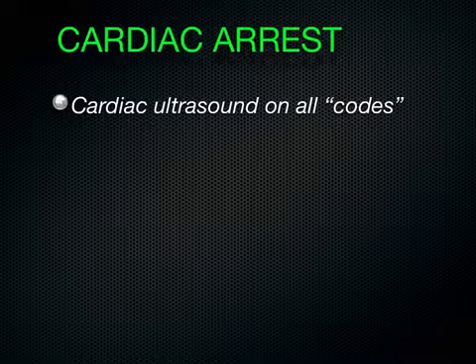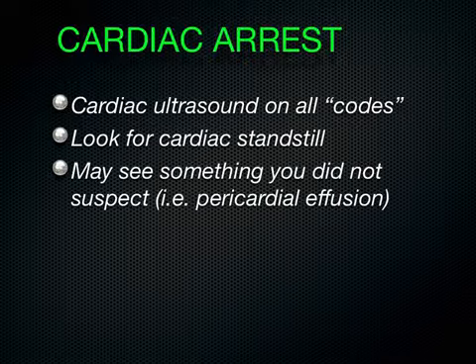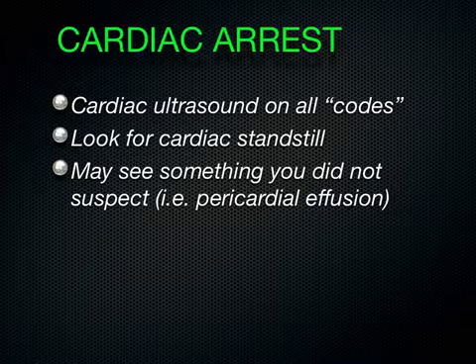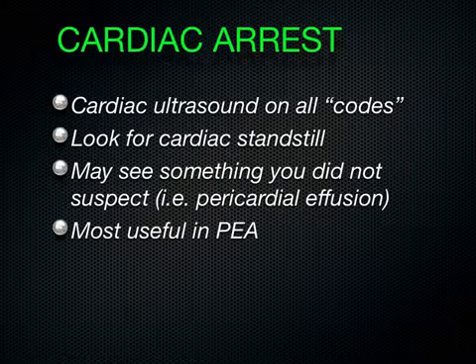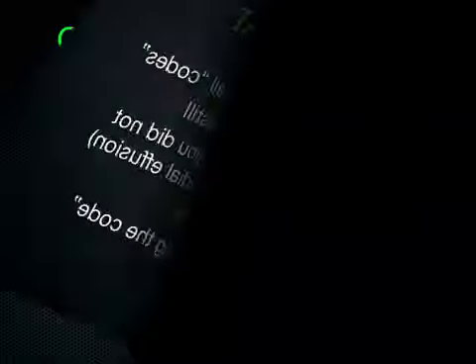Well, what about cardiac arrest? We do cardiac ultrasound on all our codes throughout the hospital now. We're looking for cardiac standstill or something else that we didn't even expect during the code, like a gigantic RV or pericardial effusion, which is why this is helpful in PEA and can be helpful in calling the code.